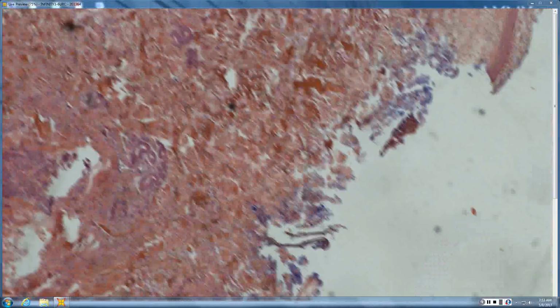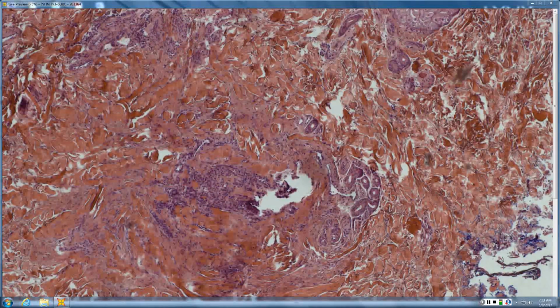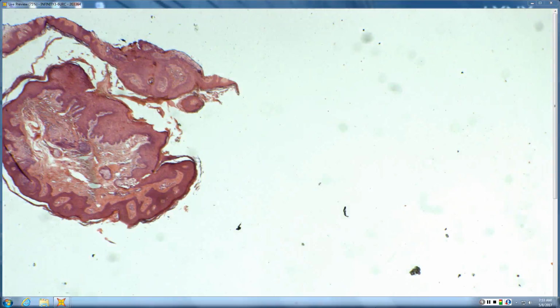Something definitely deeper. They kind of have the round look of glomus cells. Damn, you're good. That's exactly what it is. It's the very edge of a glomus. Not a lot of glomus to go on. Incredible. That deserves applause. That was very, very well done. Dr. Richard Marshall. Incredible!